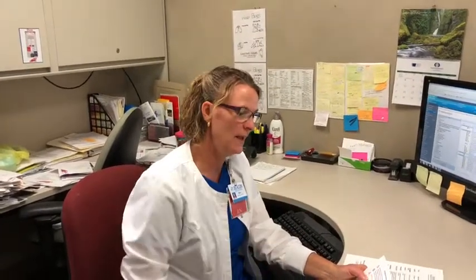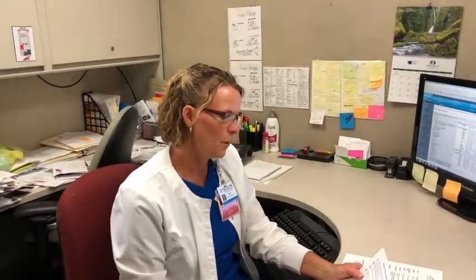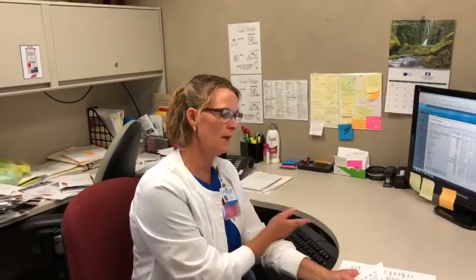So there will be this prepared video that's going to be on Workplace and a picture guide that you're going to be using, which I'll reference and show you in a minute. So the workflow, all patients presenting to emergency room wearing an insulin pump must have it documented in the home medication part of Cerner that the pump exists. Not a lot of details, just that it's there. And Dara has worked with me and the pharmacy techs that work in ED. They will be doing this. I need to show you how to do it in case the pharmacy tech is not available.